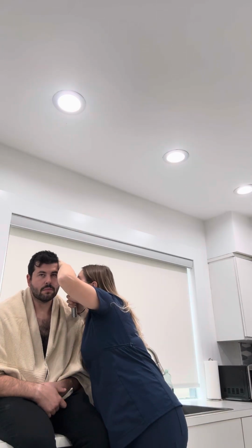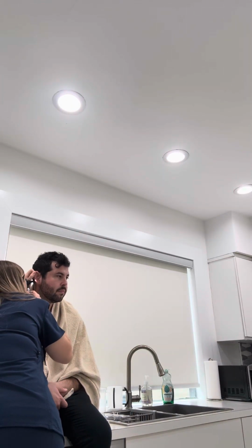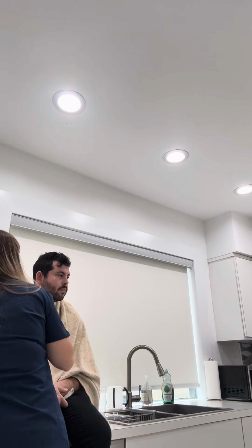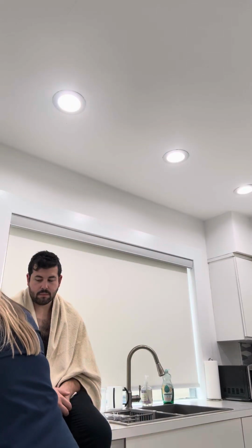Tympanic membrane is pearly gray in color. Malleus is observed. Now I'm going to be doing the same thing on the other ear, pulling your ear up and back. Okay, no abnormal findings. Cone of light is seen at 4 o'clock on the right ear. Now I'm going to be testing your hearing.